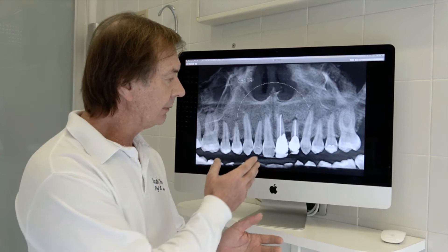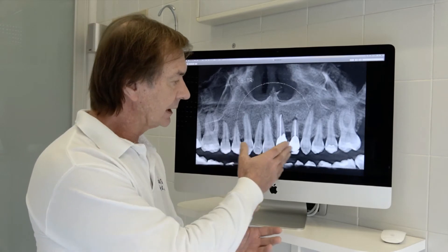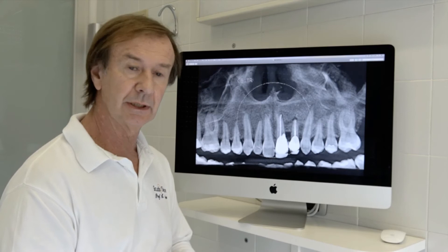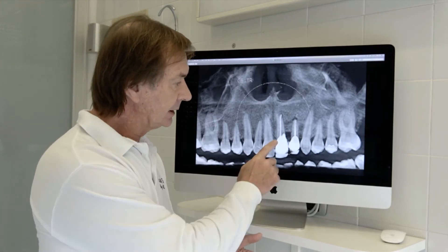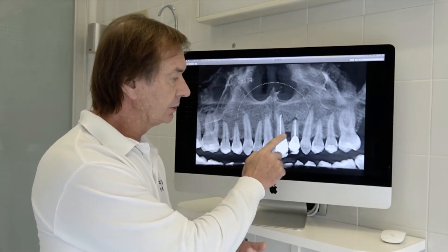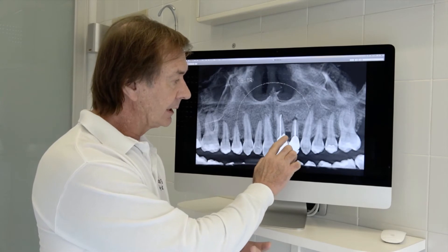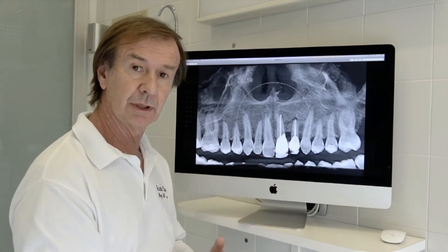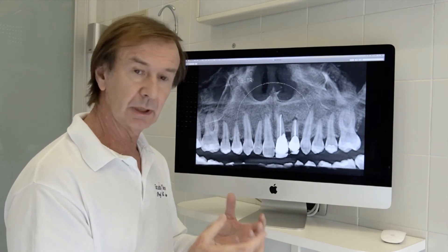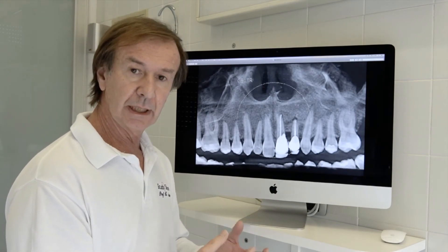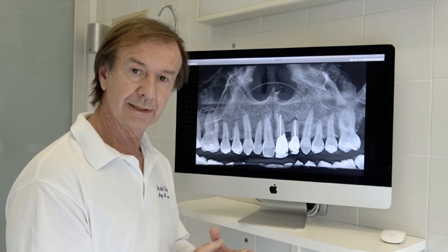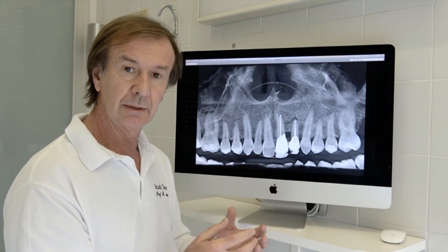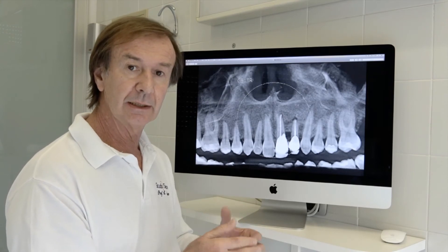In this surgery, you will see the extraction of two teeth: the left central incisor and the left lateral incisor. Due to the high compromission of the root structure of both teeth, we also have attachment loss at the level of the proximal bony peak and a flat papilla, making this a significant aesthetic problem.